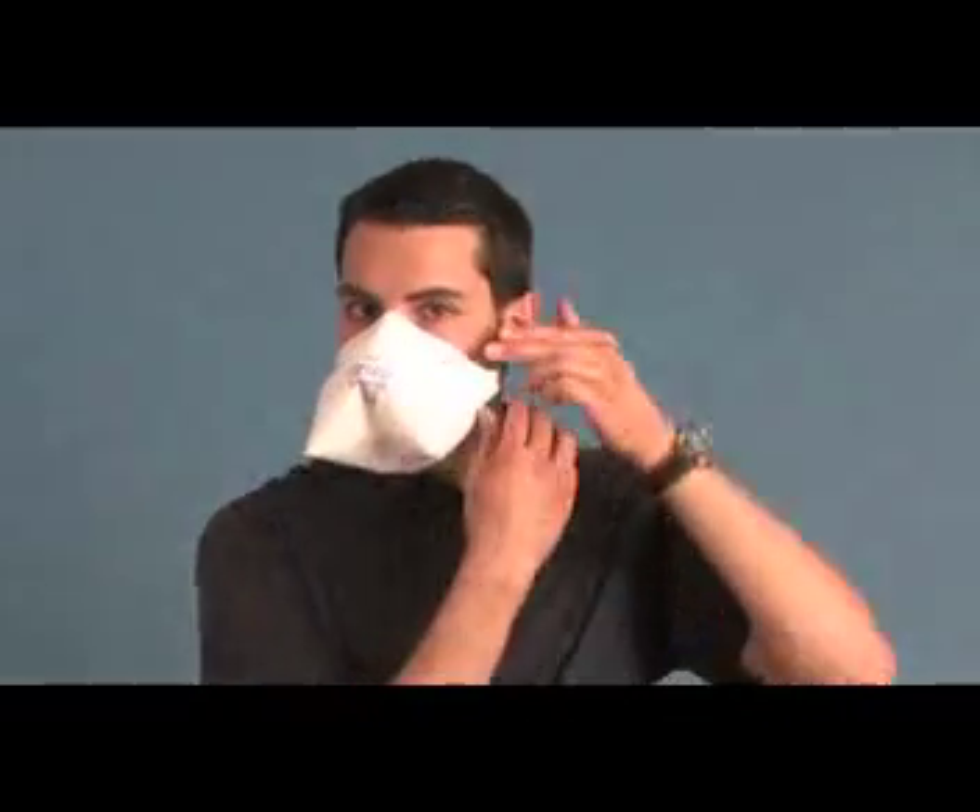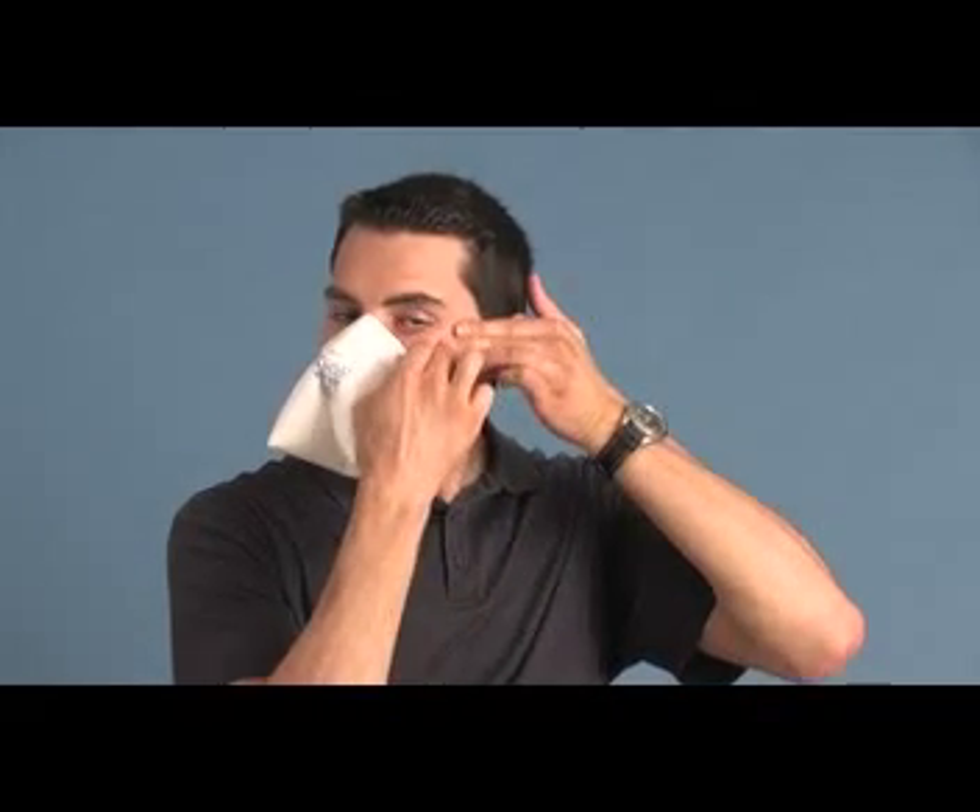Do not rip or pull the respirator off your face. Always support your skin when removing the respirator and gently peel the respirator away. While supporting the skin with the opposite hand, start at the point where the respirator is closest to your ear. Loosen the adhesive and peel the top of the respirator away from the skin across the bridge of the nose from one side to the other until the top of the respirator is detached from the skin. Once the top is removed, continue to roll it down toward the chin, keeping it close to the skin until it is fully removed.